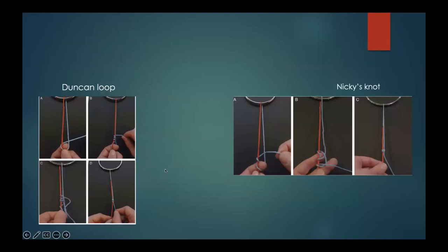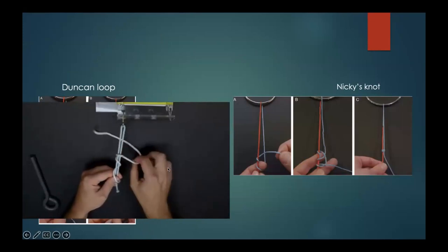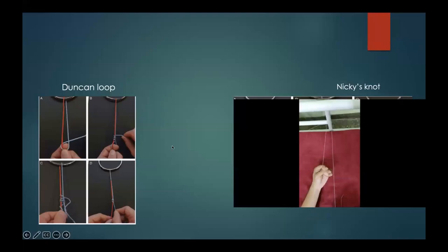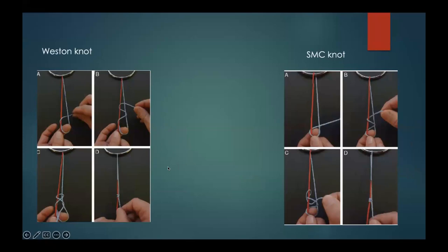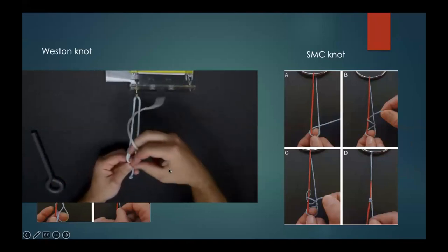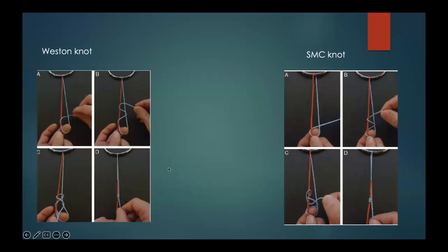Some commonly used knots are, first, the Duncan loop. Next is the Nicky's knot. Third is the Weston knot. And lastly is the Samsung Medical Center knot.